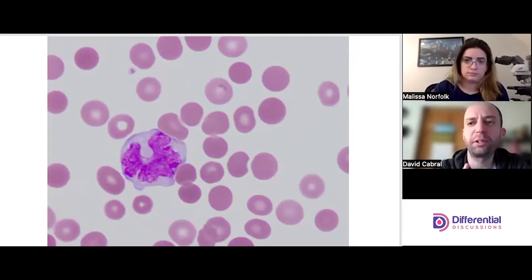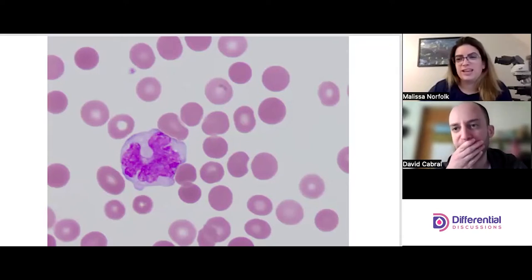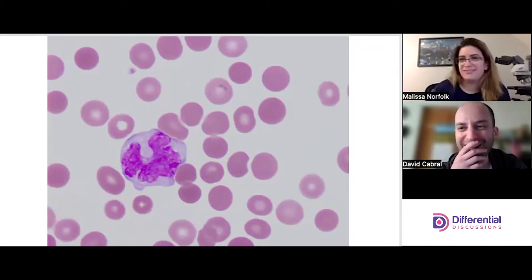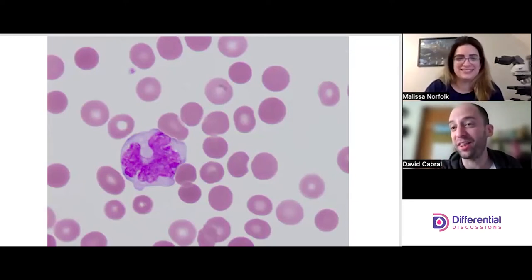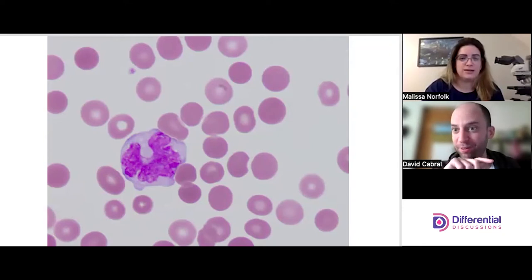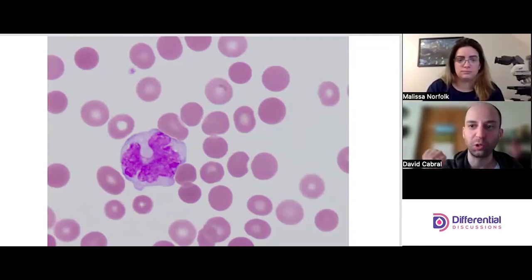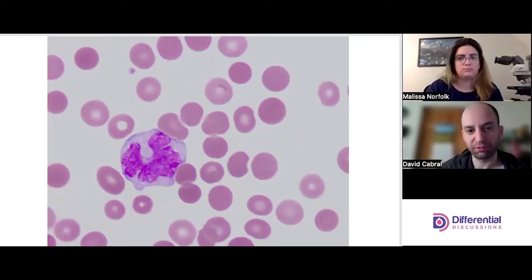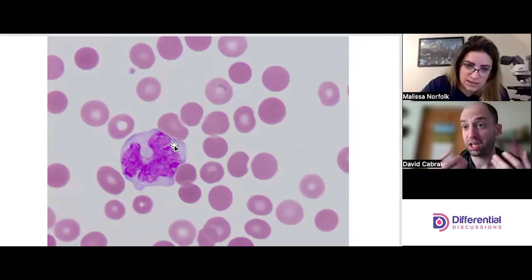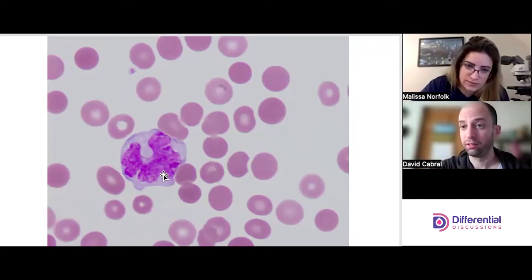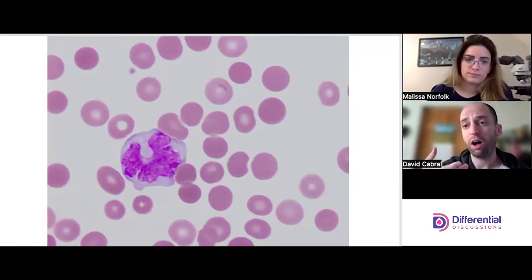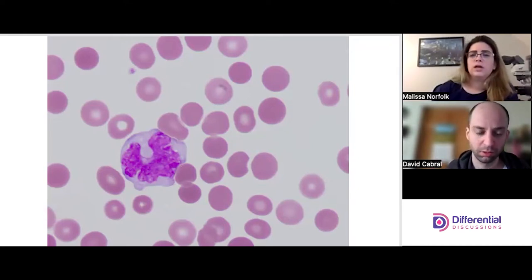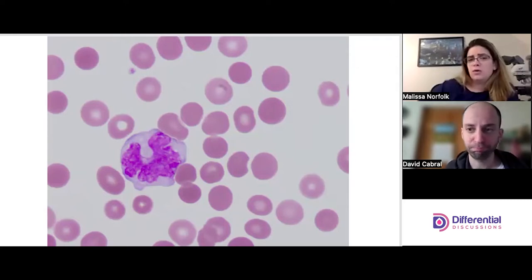We also need to talk about the nucleus. The shape, the folds — I'm sensitive to those. The chromatin pattern is kind of loose and lacy, and I'm paying attention to that chromatin pattern.